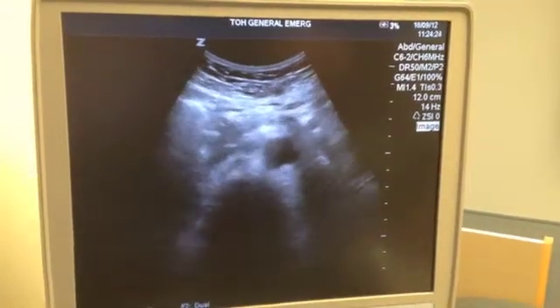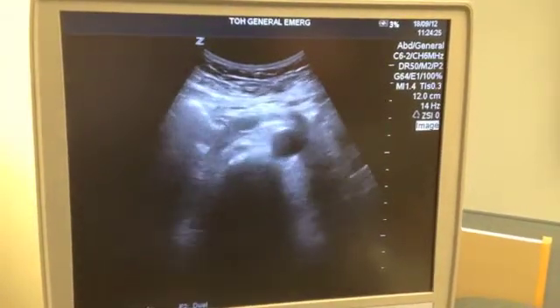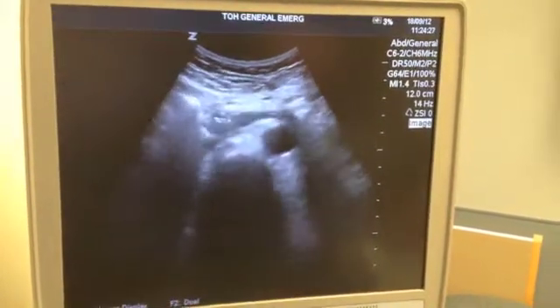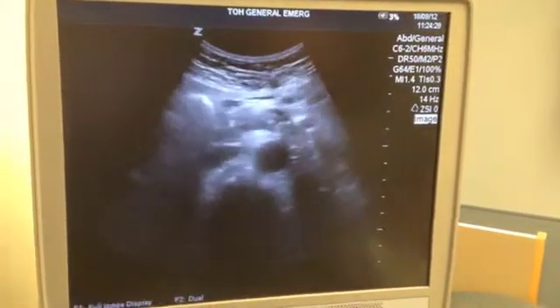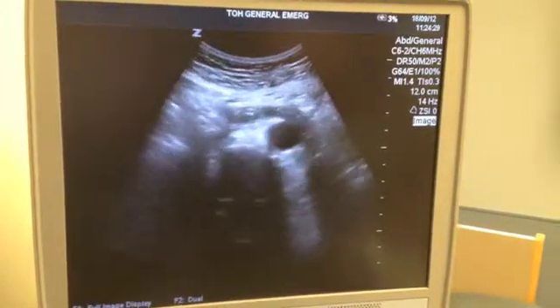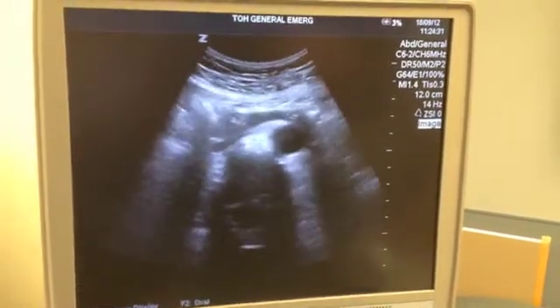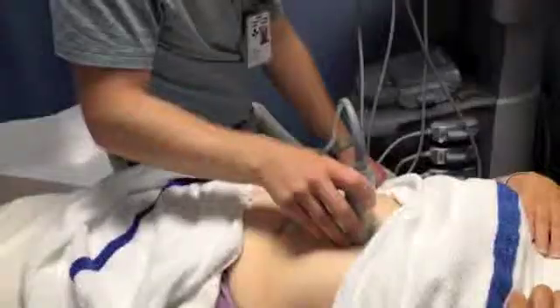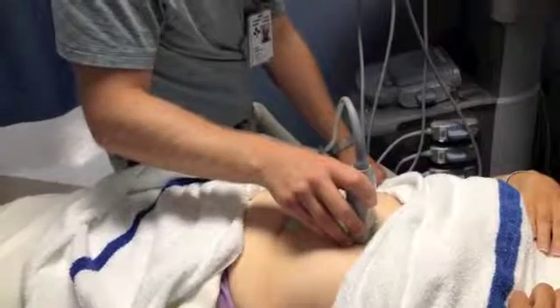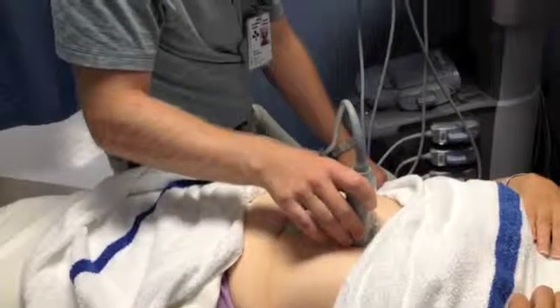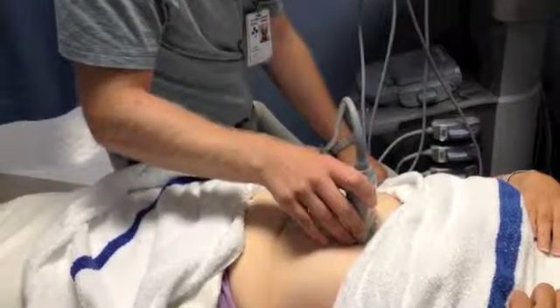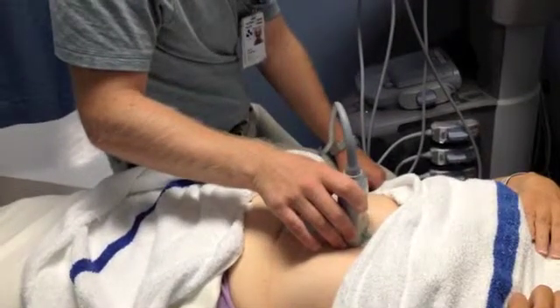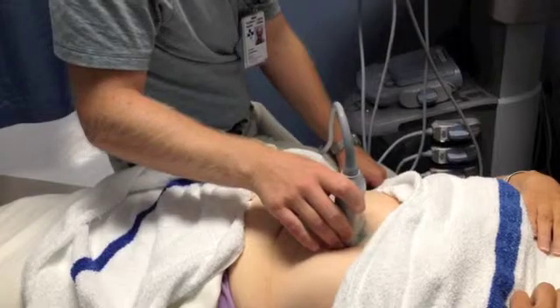The aorta is not compressible — as I apply pressure, it's not getting smaller. Screen left of the aorta, you can actually see the IVC, which is compressible. I'll identify the aorta on the screen, and once I'm sure I see it, I'll follow it down.